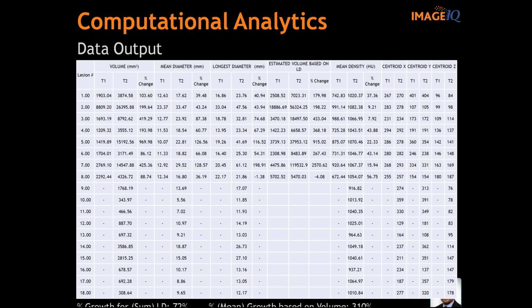It's harder for a manual observer who is drawing around the nodule. You can look for cavitations. The data is very structured and comes out for them. I know you're going to talk about the volume here, but I also see attenuation or density on there as well. Right. For some of the people on the phone, they may be studying certain types of tumors where they're going to use a criteria that incorporates density measurement, whether that's liver tumors or GIST tumors. It also depends on the therapy too, not just the type of tumor. So these organized outputs are very helpful for those kinds of trials.